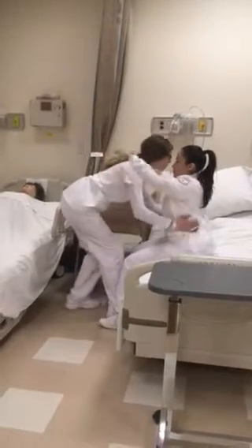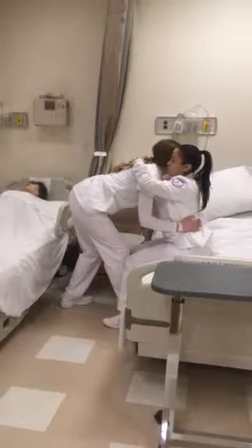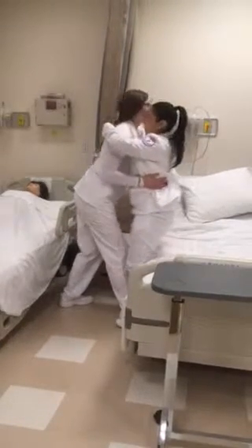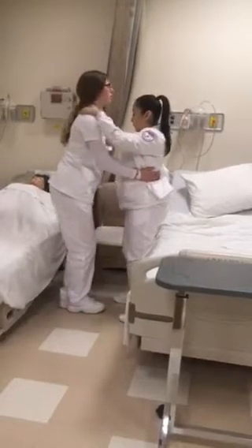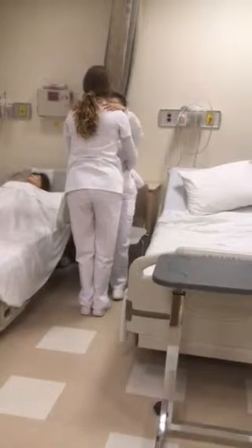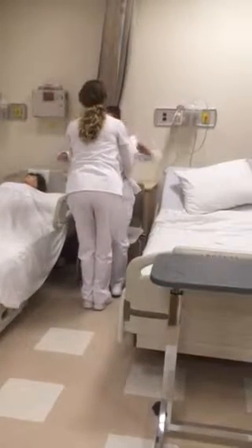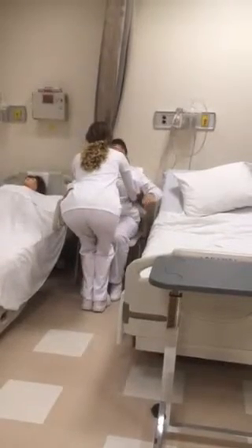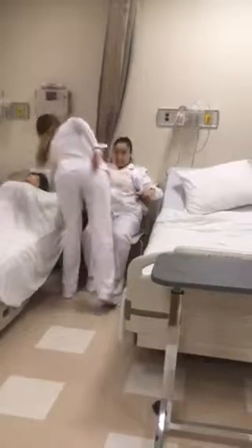Alright, so let's get set up. You can put them around, thank you. And on the count of 3, we're going to lift up, okay? 1, 2, 3, up. Okay, so we're going to pivot over to the wheelchair, right? Okay, slowly. Okay. Do you feel the wheelchair behind you? Alright, perfect. We're going to start lowering you down, and you can reach for the side handles. Okay, perfect. You want to make sure that they're in place, they're locked, and that everything is perfectly good.